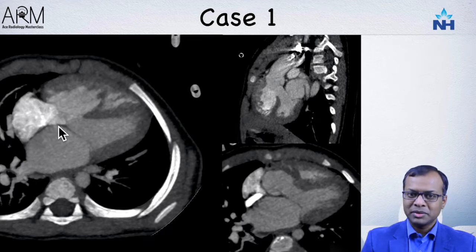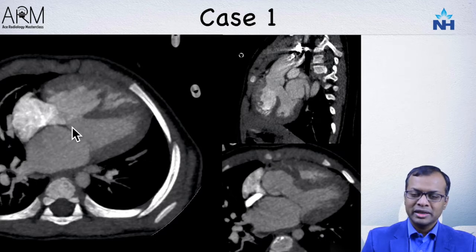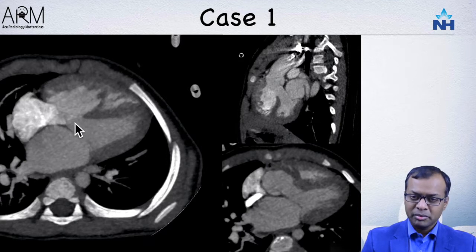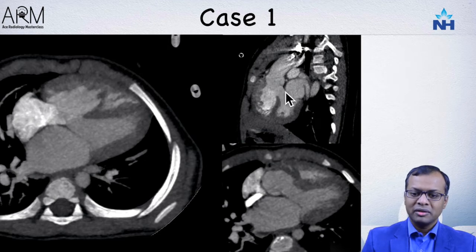The next important step is to look at the interatrial septum and interventricular septum. In this case there is a deficient interventricular septum — a VSD — with no obvious ASD. VSDs lower down are considered muscular VSDs, while those higher up tend to be membranous or perimembranous. Looking at the relationship of the aorta with the VSD, you can see the aorta is overriding the VSD, getting its blood from both the right and left ventricles.